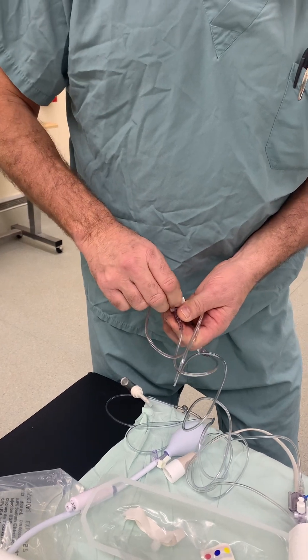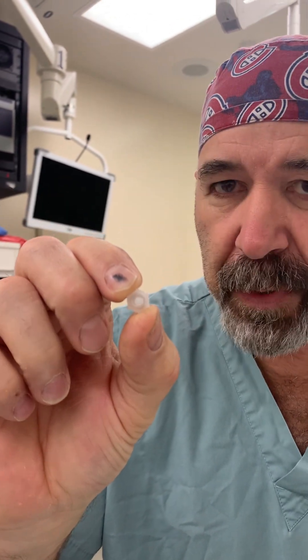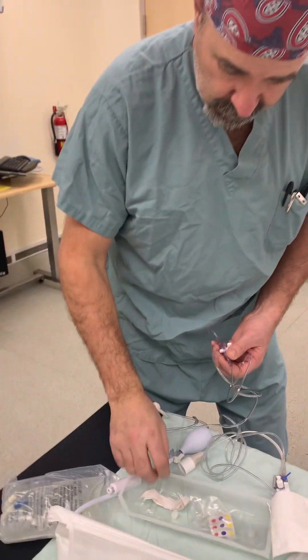Let me show you the hole in the vented cap — see the hole there? If the valve is open, the patient can exsanguinate. So please be mindful of that.